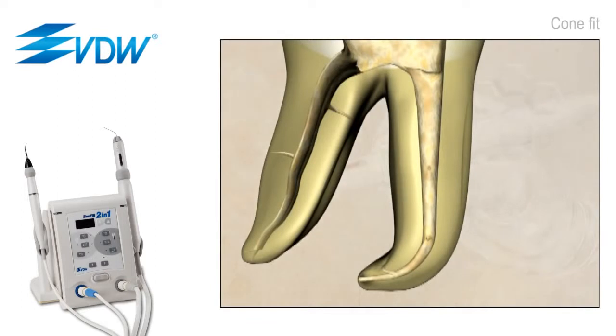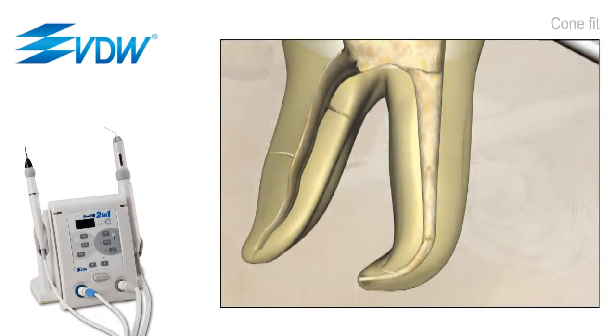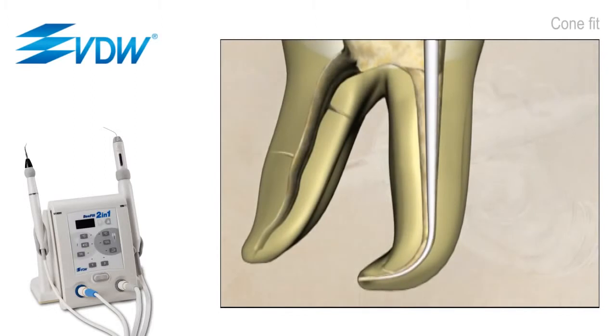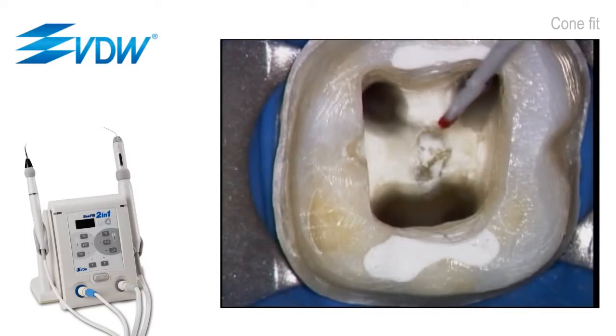Cleaned and shaped, it is time to fit a master cone. One way of determining a final working length is with a paper point. A paper point is inserted to the length. It should come back clean and dry. Insert the point a bit further than the previous point. When the paper point comes back showing red, you've gone past the apex.